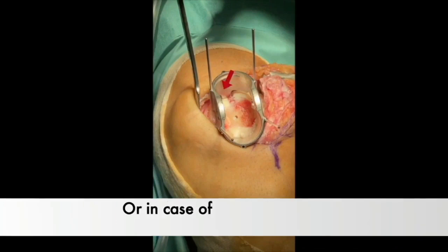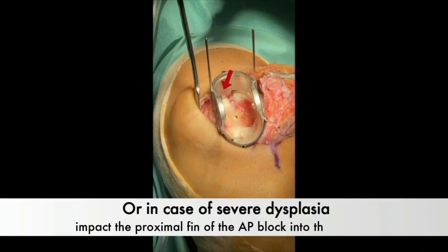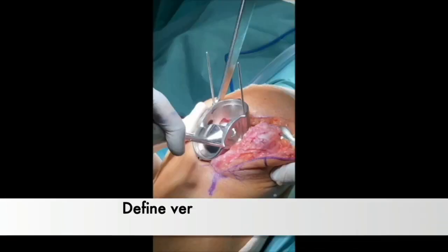If this measure fails to prevent instability, it could indicate the potential presence of severe trochlear dysplasia. In these cases, impacting the proximal fin of the block into the trochlea achieves final stability.